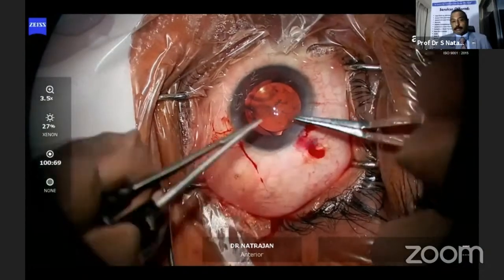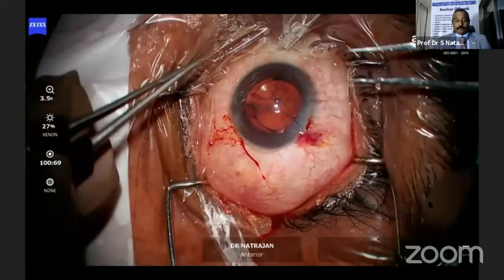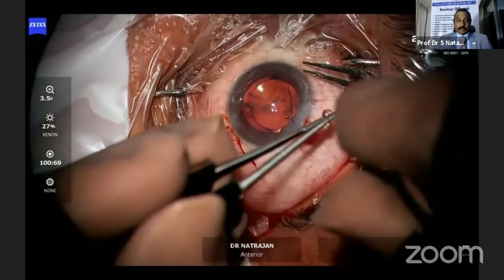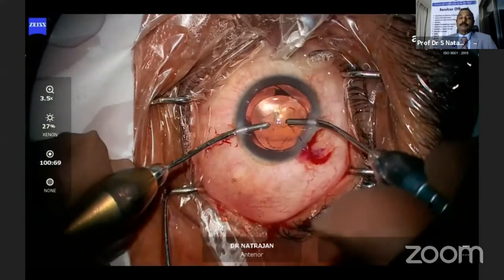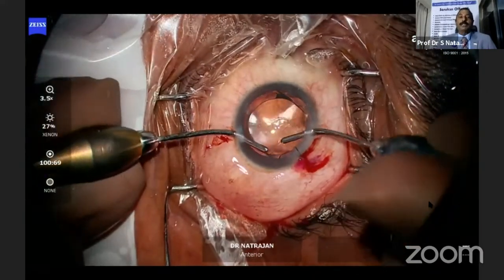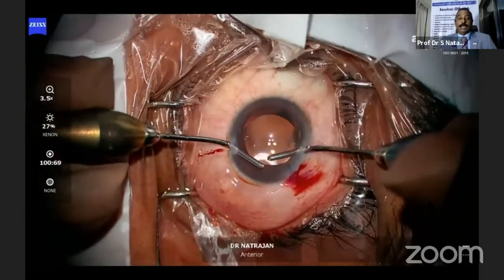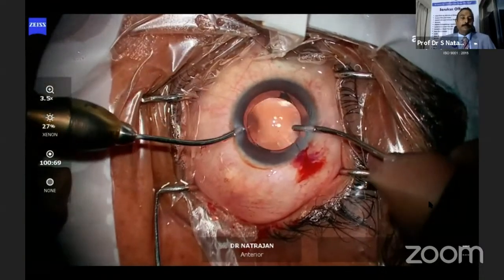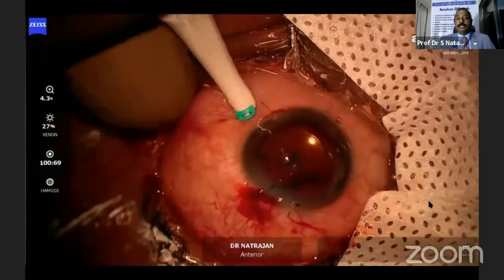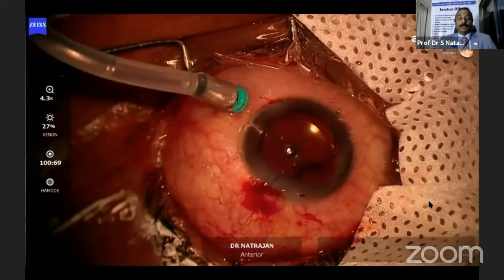And then later, even for teaching, and here, because we're going to do a report, vitrectomy following that, Kavita Rao places one suture and completes the cataract with the intraocular lens implant. And then after that, I proceed, because I don't like the cataract surgeon coming back again, because I don't do cataract, neither do I do any PK or anything, but I make the cataract surgeon do everything. And I usually tell them, do your part and get out, and then I get in. And that's what I'm doing here.